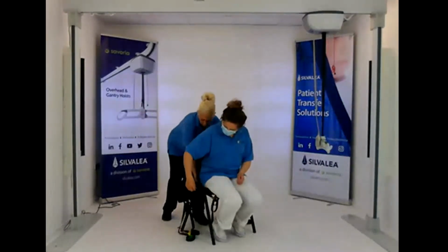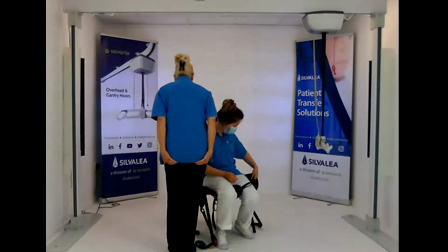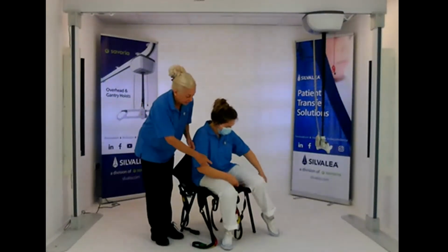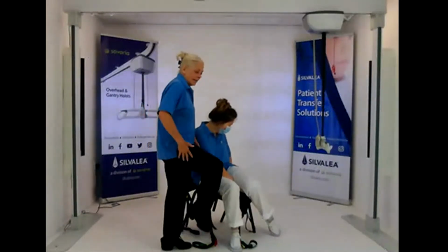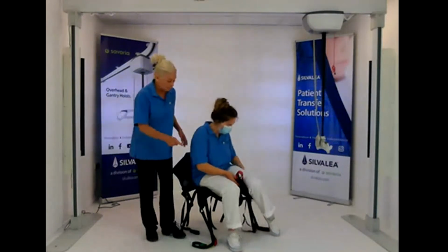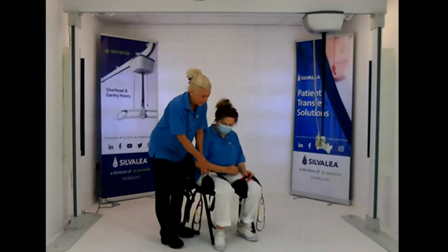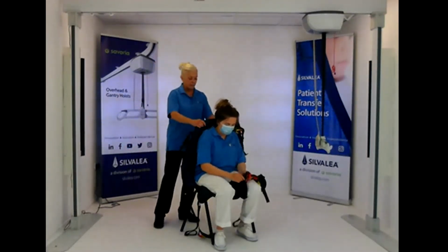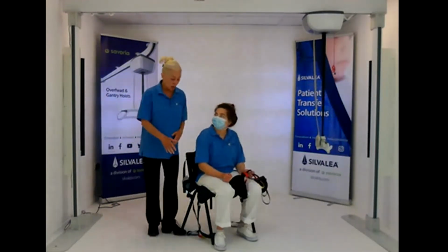I'm just going to make sure. So with slings, it's important to get them really down behind the bottom here, so the leg sections can come around and fit towards the knee. If you're fitting it quite high, the leg sections will be too far back and then they'll bite into the groin. So it's really important to get them down towards the knee. Top section will sort itself out. So don't think I've got to line this up to make sure it's in the right place. No, just get it down and low. It's more important.